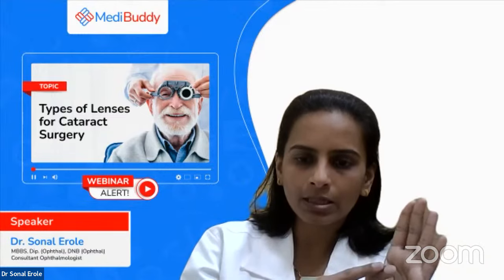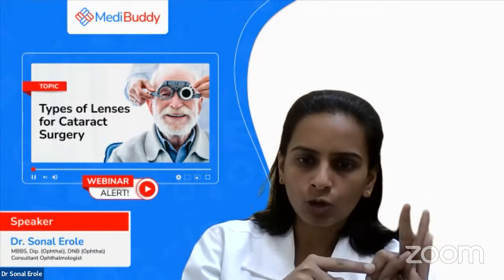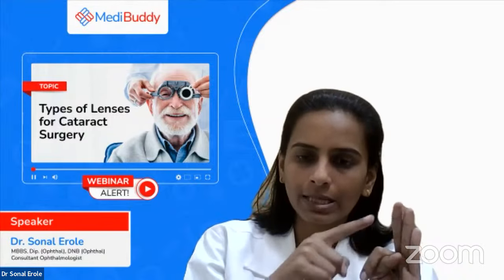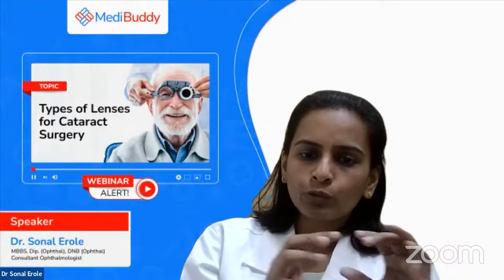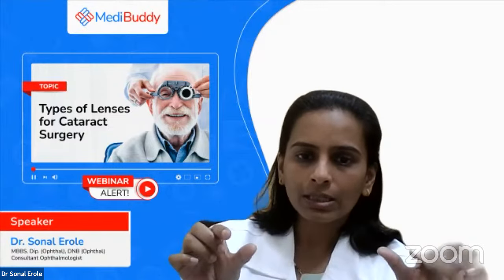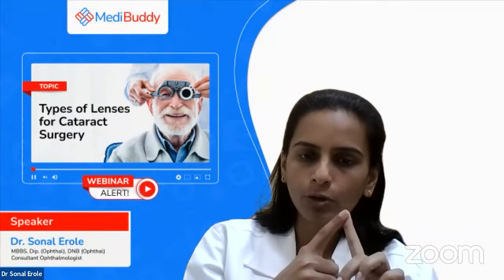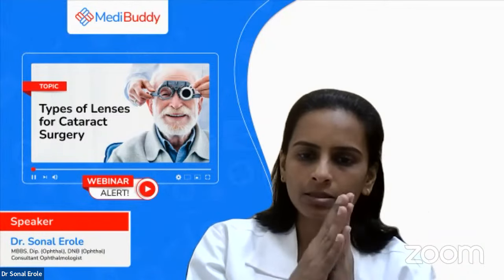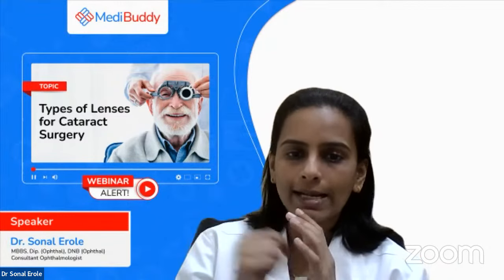We have LASIK, which is with a blade. Then we can have LASIK without a blade, that is femto laser. Then we have options like SMILE also. And sometimes what happens is your cornea is very thin. So in such patients, we have the option of PRK. We can also have a lens, the implantable collamer lens, that is the ICL lens.